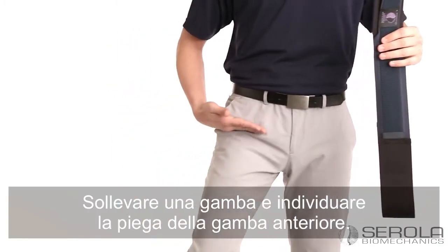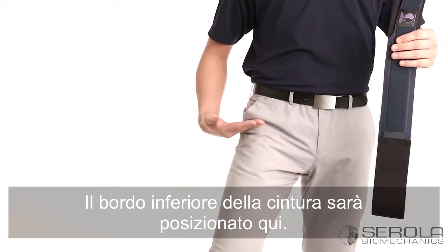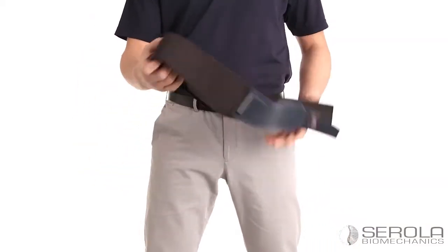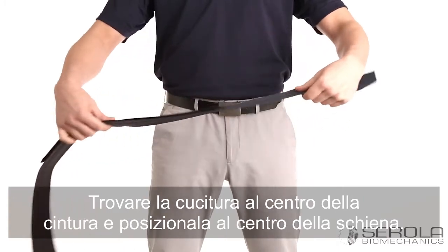Raise one leg and locate the front leg crease. The bottom edge of the belt will go here. Find the middle seam of the belt and place it at the middle of your back.